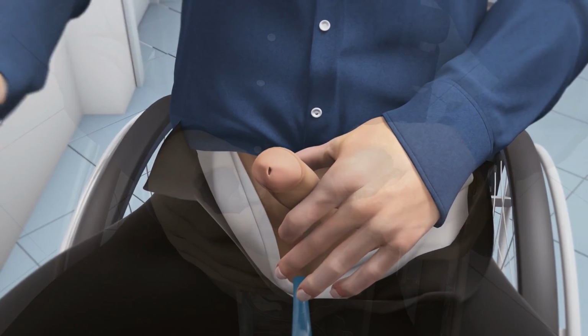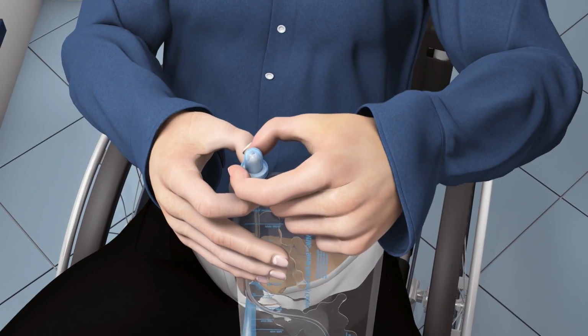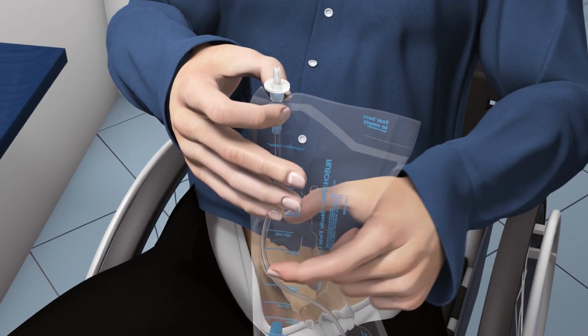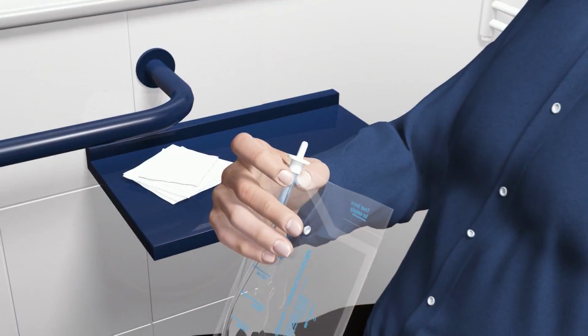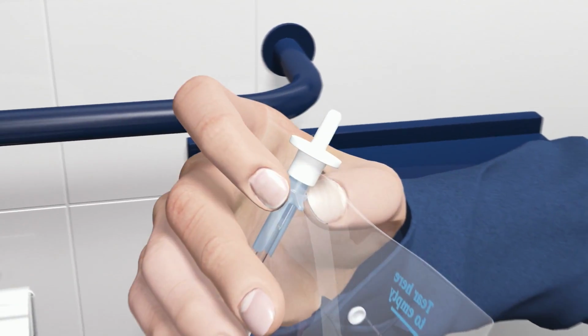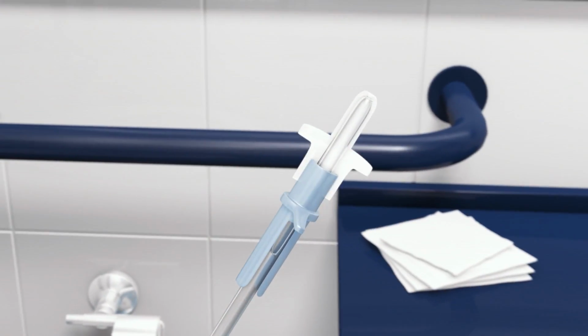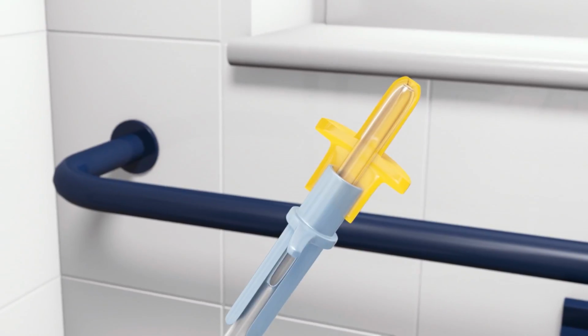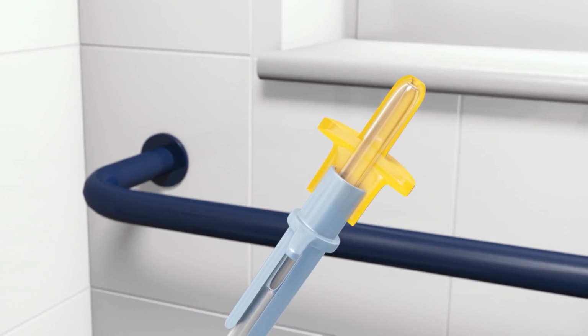Remove the protective cap to expose the introducer tip. While holding the split introducer guide in one hand, feed the pre-lubricated catheter tip forward until it is about to come out of the flexible introducer tip. This helps give the introducer sufficient firmness to enter the urethra opening. The catheter should now be loaded into the tip so that the tip is firm.